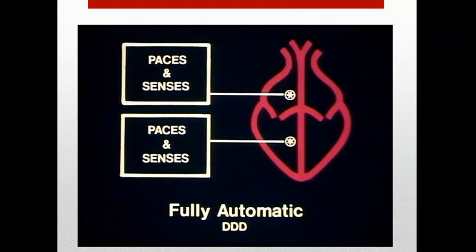A sensed P wave in the atria will inhibit the atrial pacing spike, and a sensed R wave in the ventricle will inhibit the ventricular pacing spike. So there's an inhibited response to the pacing stimuli to sensed events in their respective chamber, and there can be a triggered response to sensed atrial activity to allow for rate responsive ventricular pacing.